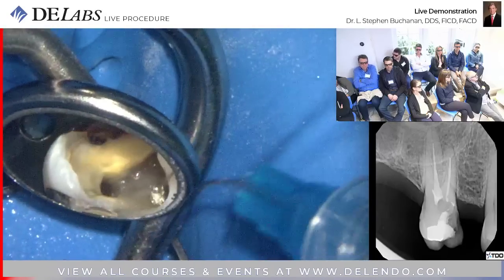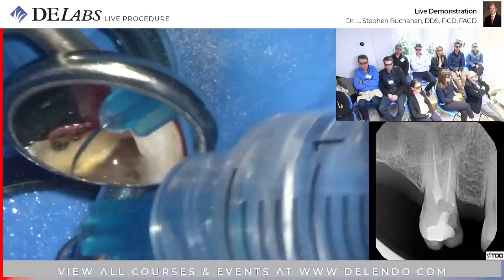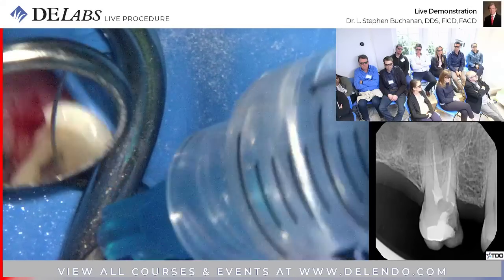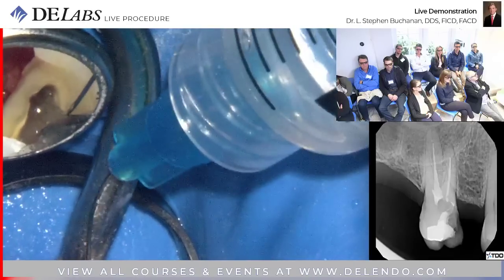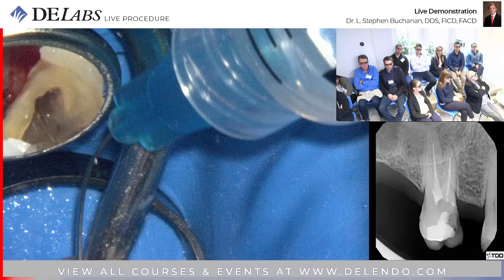Okay, well, the bleeding actually has kind of stopped by itself. That's nice. This is hypertonic saline, 4%, which also promotes hemostasis. Nice. Okay, let's just cauterize this.